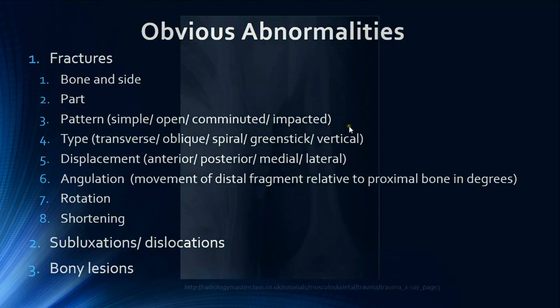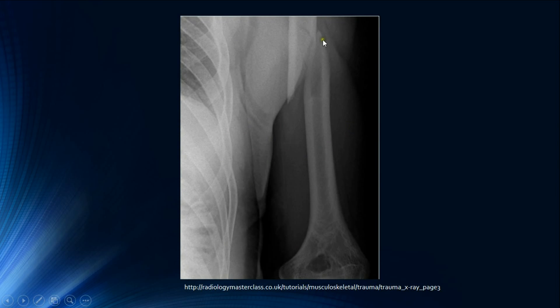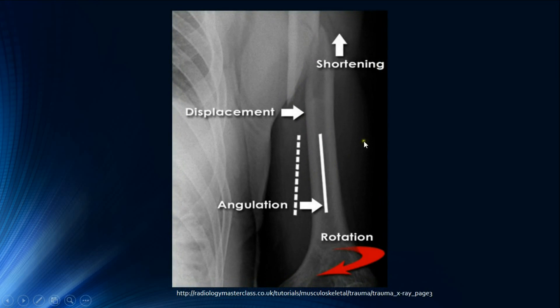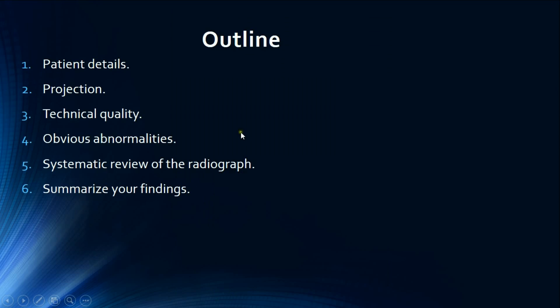Here is a quick summary for describing obvious abnormalities. This is a fracture of the left humerus with the fracture in the mid-shaft. It is an oblique fracture, and the distal fragment is laterally displaced with valgus angulation, internal rotation, and shortening of the bone. You can clearly see the lateral displacement, the outward angulation indicating valgus, the rotation, and the shortening as the distal fragment is pulled proximally.